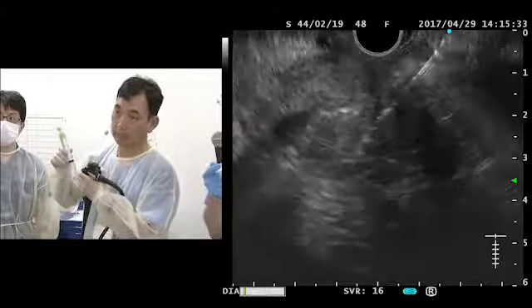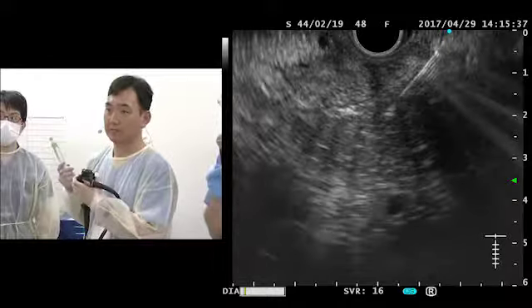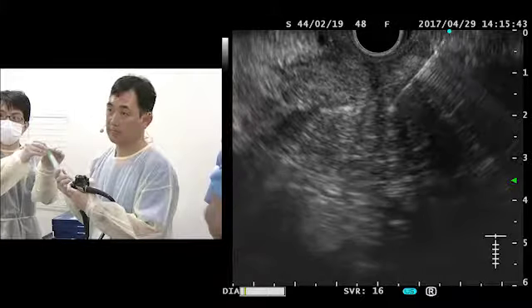So any question from the audience? Okay. So now we needed a really fast. Okay, so let's do clear. Push the stylet first, and then slowly pull back.